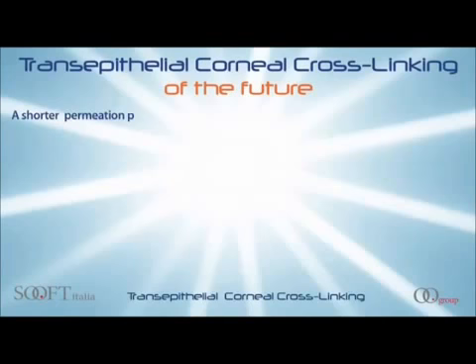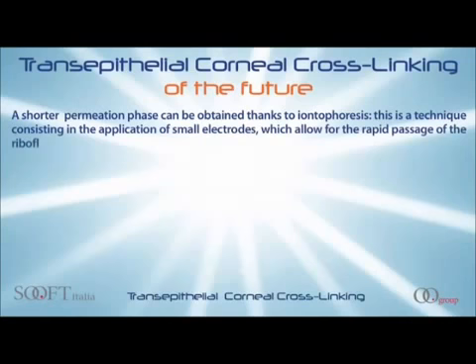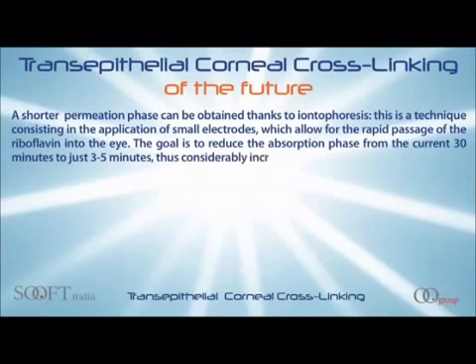A shorter permeation phase can be obtained thanks to iontophoresis. This technique consists in the application of small electrodes, which allow for the rapid passage of the riboflavin into the eye. The goal is to reduce the absorption phase from the current 30 minutes to just 3 to 5 minutes, thus considerably increasing the compliance of the patient.